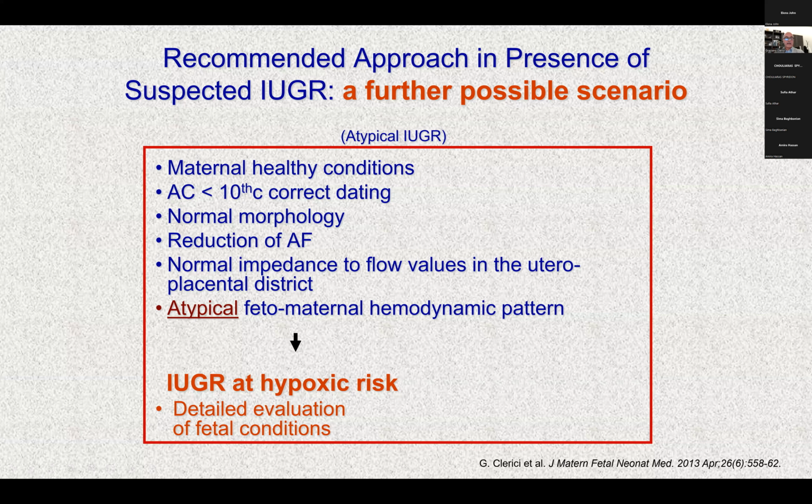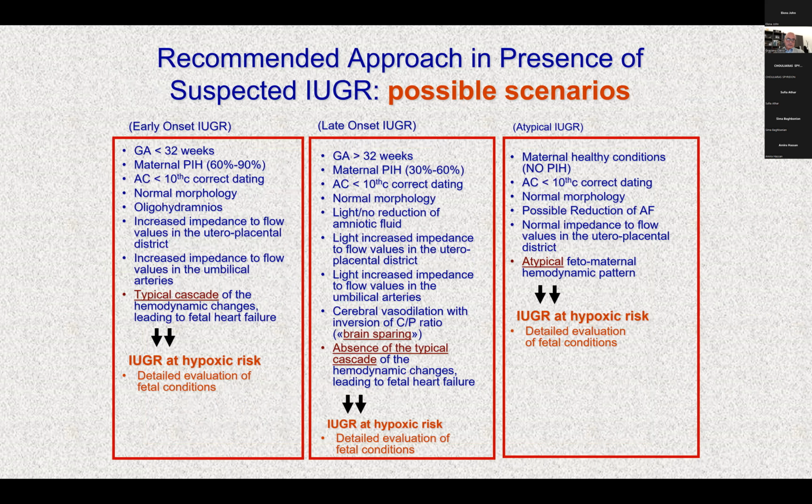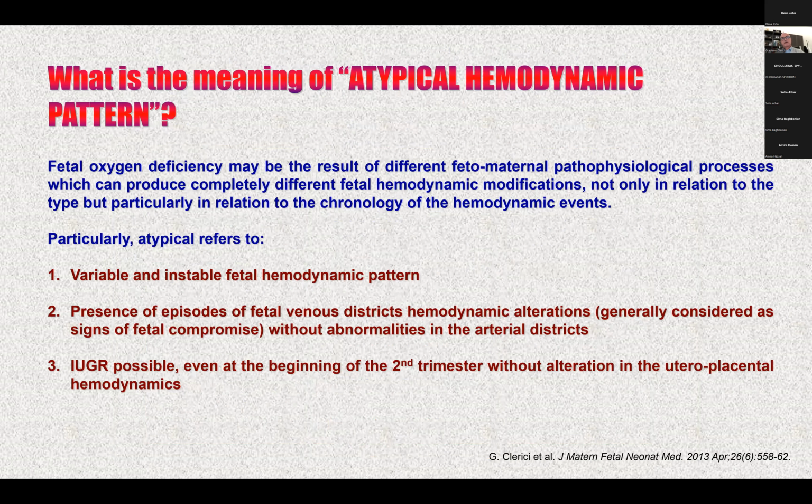And I'm going to show you there is an atypical fetal maternal hemodynamic pattern, completely different from the typical one that I showed you before for the early onset IUGR. It is important, again, to make the diagnosis of this kind of situation, because these fetuses in this scenario may have sequelae or may die in utero for the hypoxic situation. You can see the meaning of atypical hemodynamic pattern.